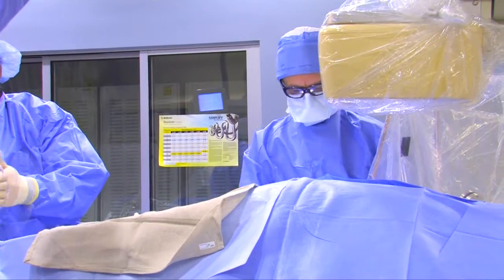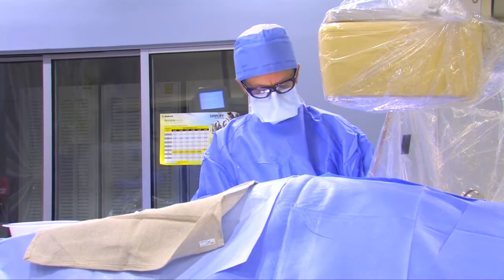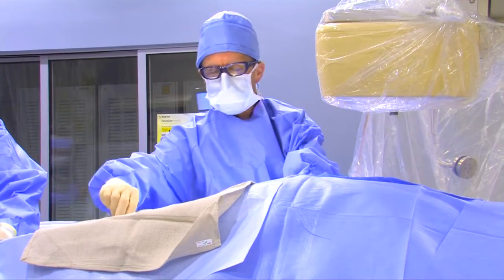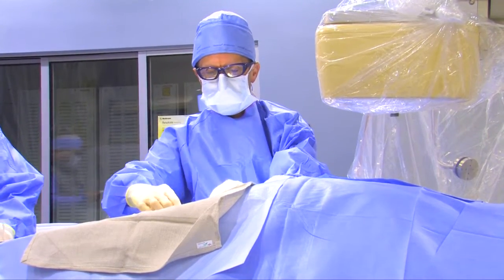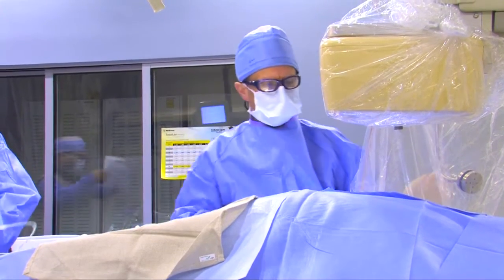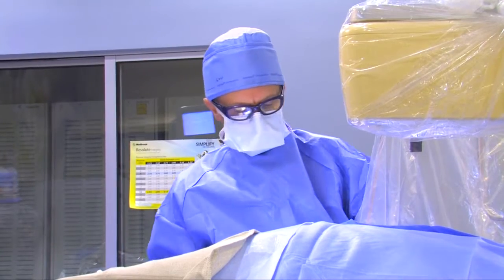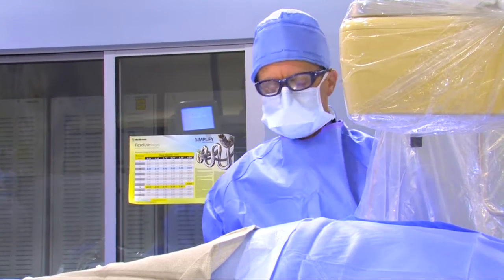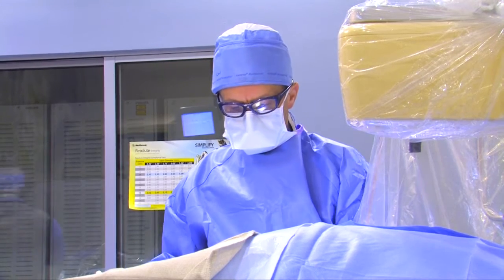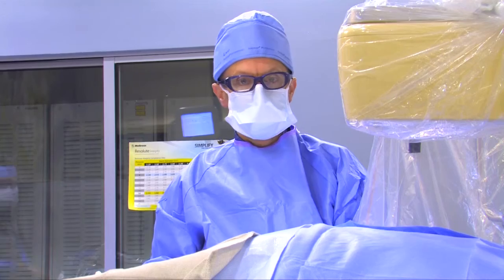I'm doing an angiogram on this gentleman who had an abnormal stress test, which showed that one area of his heart was not getting as much blood flow. A stress test is a non-invasive test, and it's not the gold standard, but we use it as a way to screen patients who may have heart disease. The next step after a stress test is what we're doing today: a coronary angiogram.